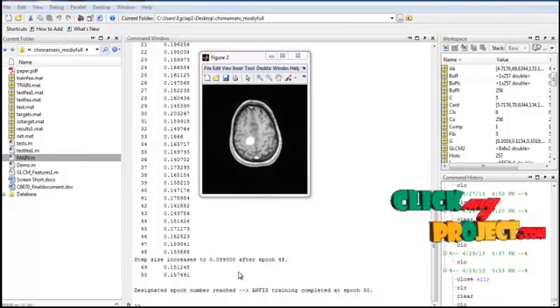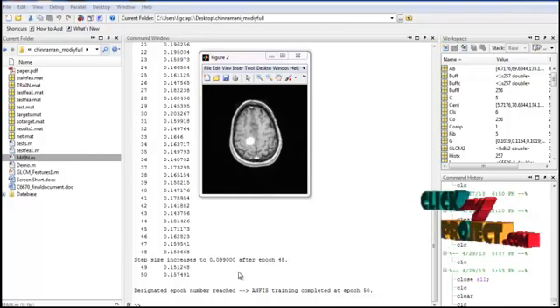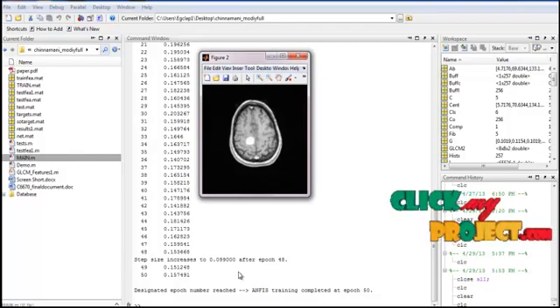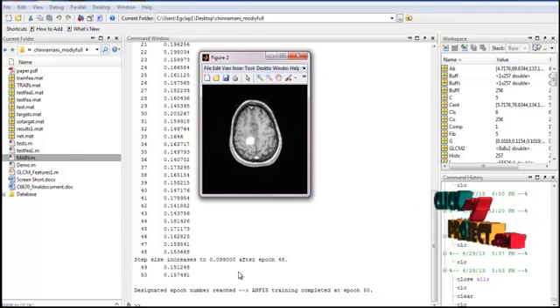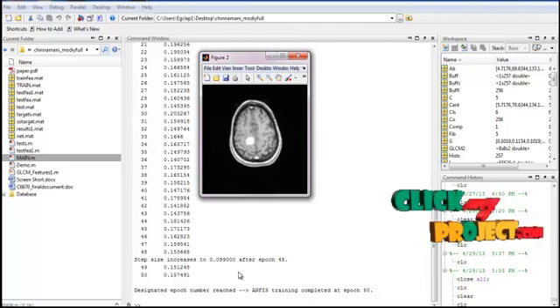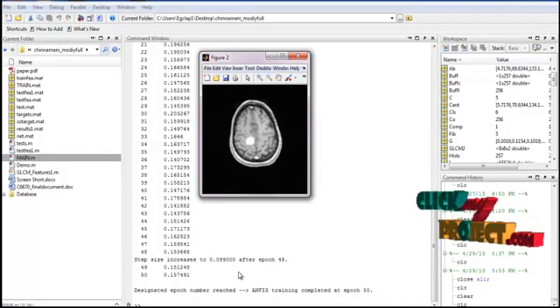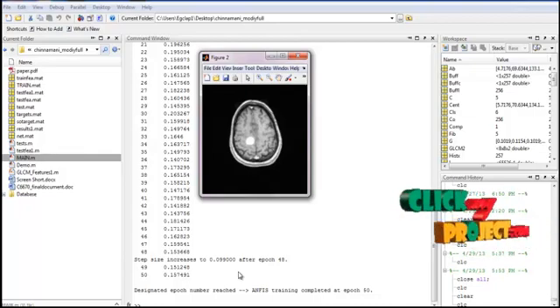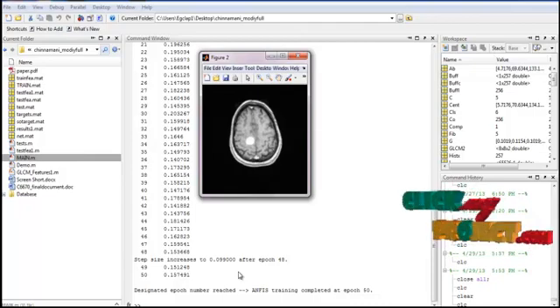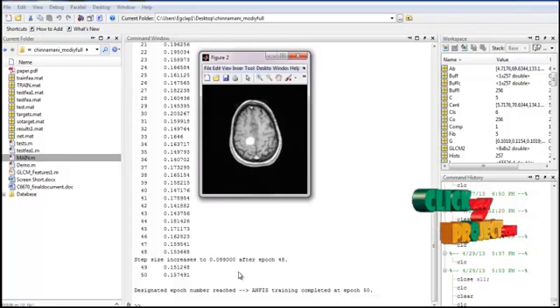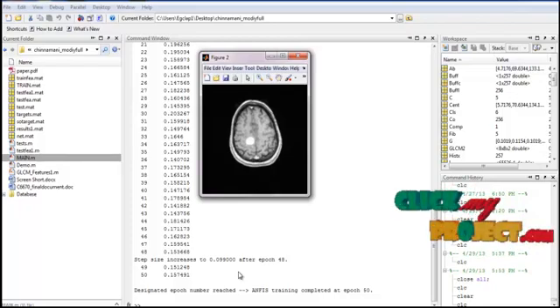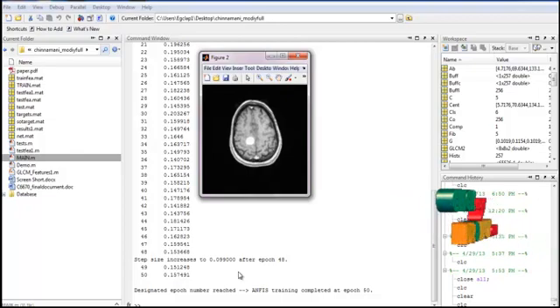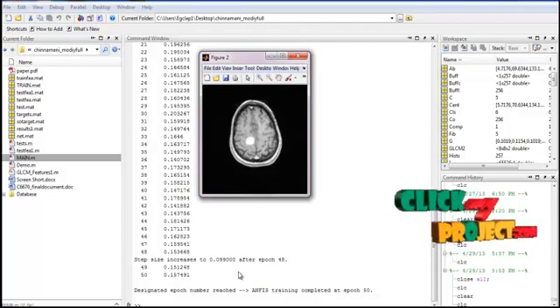Next is GLCM feature extraction. A square matrix is created with the number of levels specified under quantization. Let S be the sample under consideration. Let W be the set of samples around sample S within a window centered upon it. Each element of the GLCM represents the number of times two samples of specified intensities appear with the specified spatial relationship.